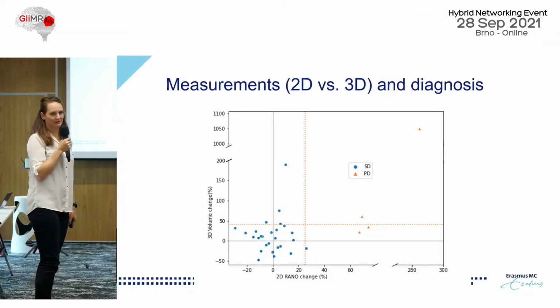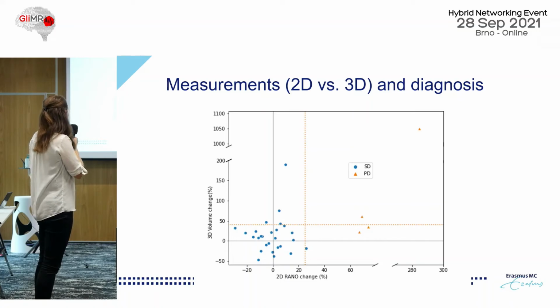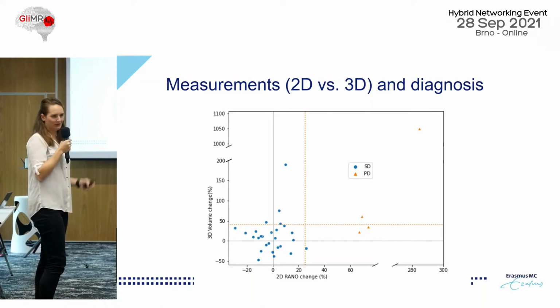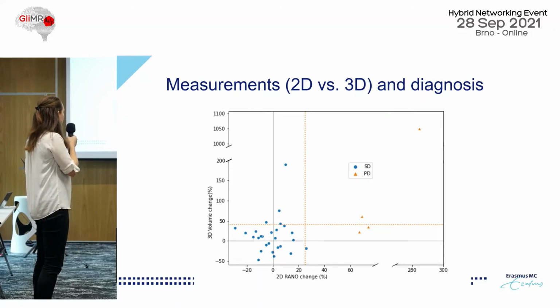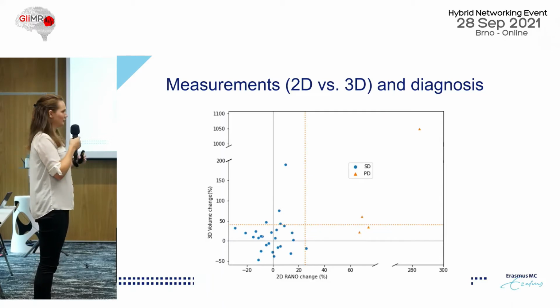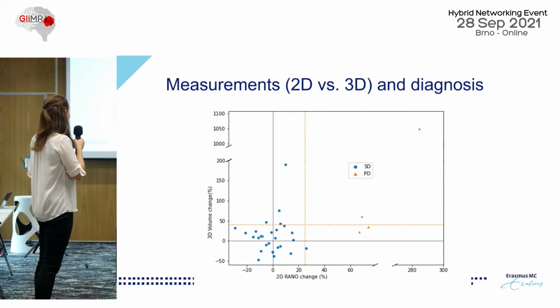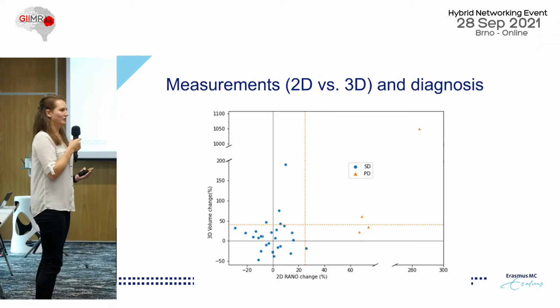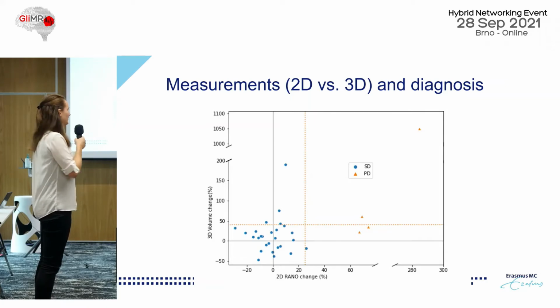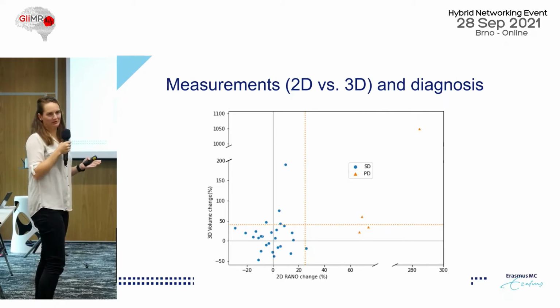We also compared the 3D volume measurements to the existing 2D measurement method, which is the RANO criteria, where you take 2 perpendicular cross-sections. And I have to say that this was performed after the study. So this wasn't actually measured in clinical practice because most of these tumors are not measurable because they are just so strangely shaped. They're not circles. So in this case, the measurements were taken at the part of the tumor that could be measured best.